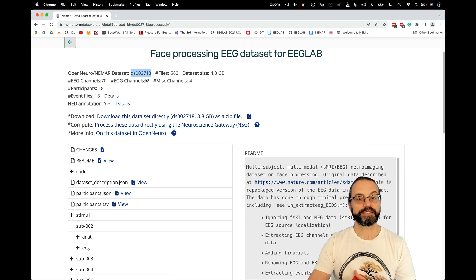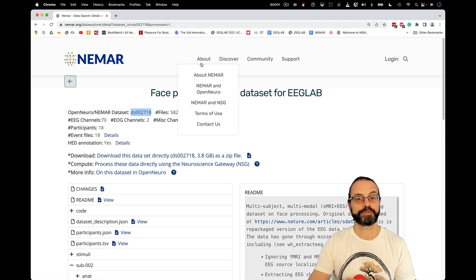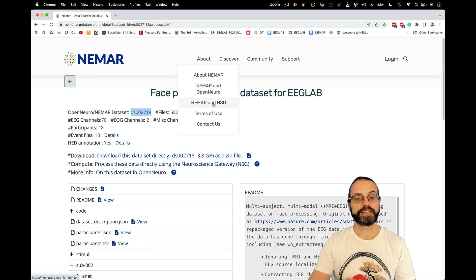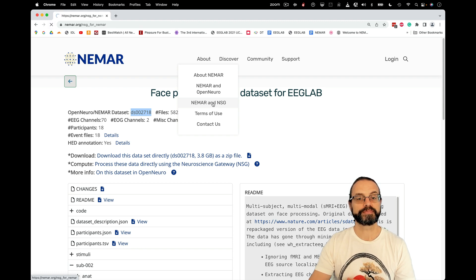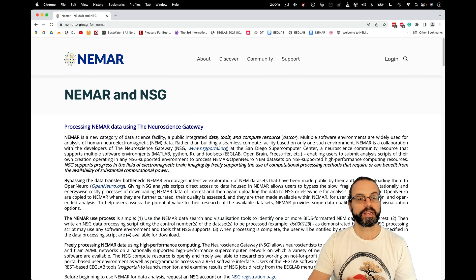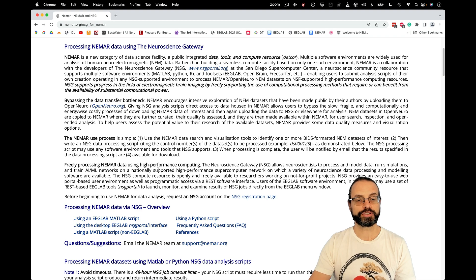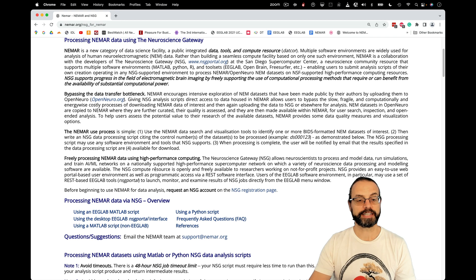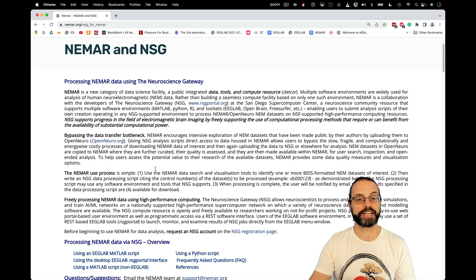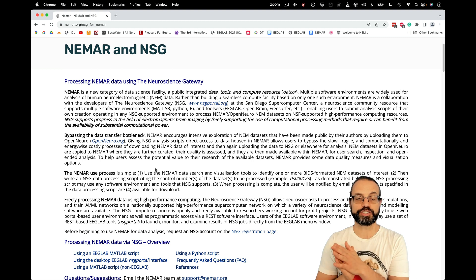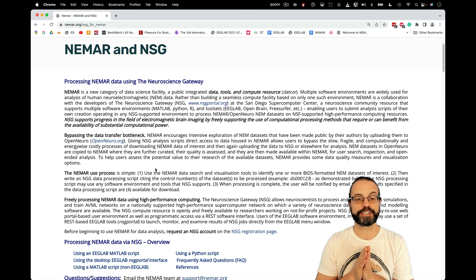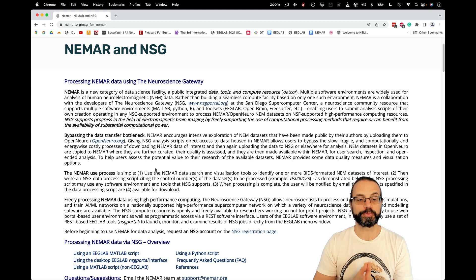Let's write down this number here, and we're going to go here, NIMAR and NSG. This is the page that describes how to process datasets on NSG, the Neuroscience Gateway, which is the interface to the San Diego supercomputer.